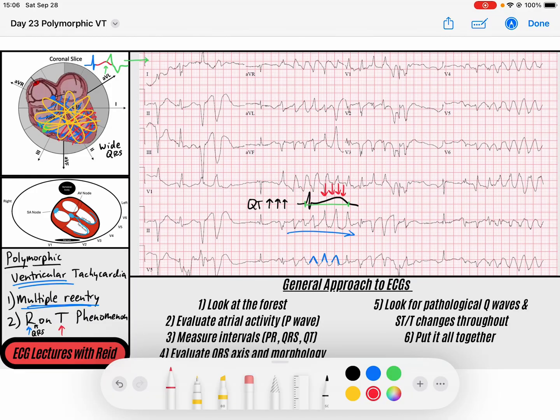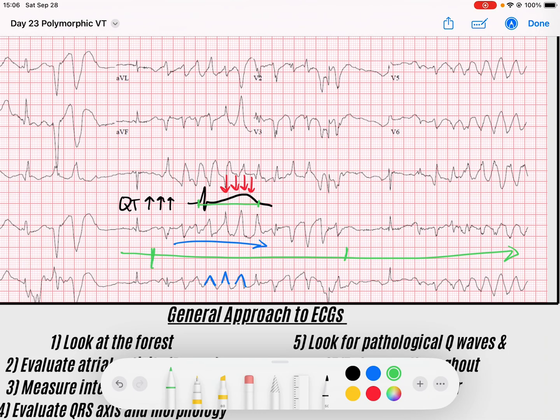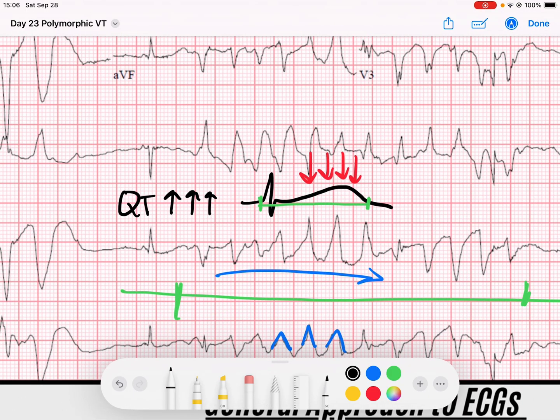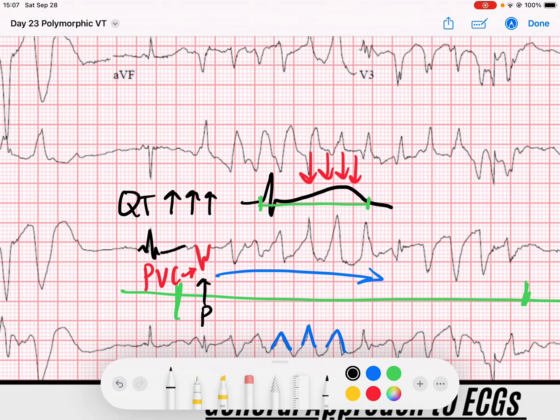So when I scan through this rhythm, I notice two runs of a polymorphic rhythm — one there and one at the end. If I look really closely, I've got a P wave followed by a QRS, and then a T wave. But before the T wave returns back to baseline, look — I have a beat, and that's a premature ventricular contraction that occurs before the preceding T wave terminates. That's the R that occurs on the T wave.